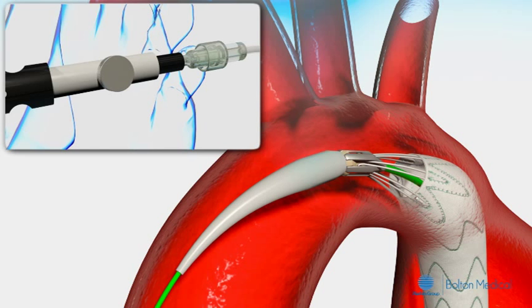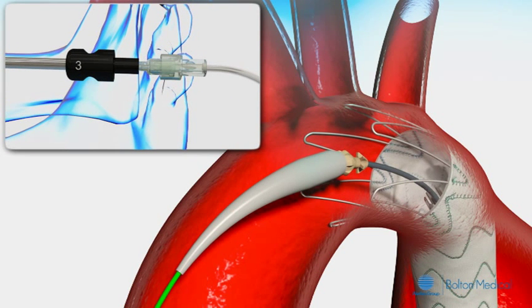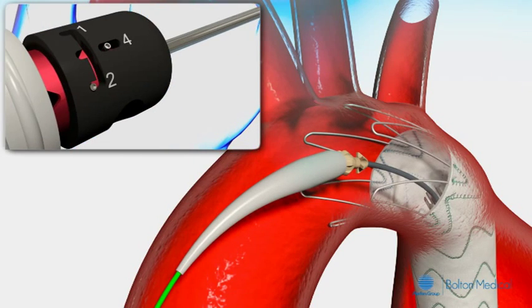Unscrew the stainless steel thumb screw on the apex retaining clip and release the bare stent by pulling the apex release grip marked 3 completely towards the guide wire lure while holding the controller and stainless steel rod firmly. The stent graft is in the final position.